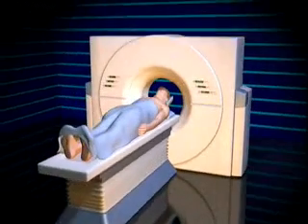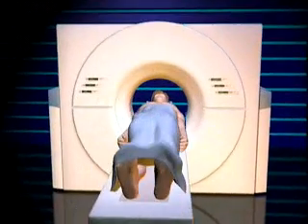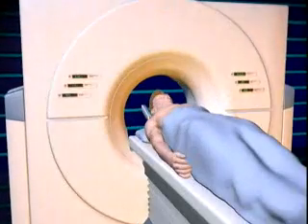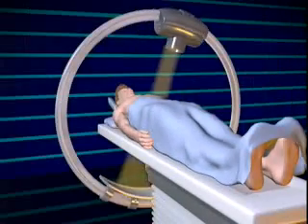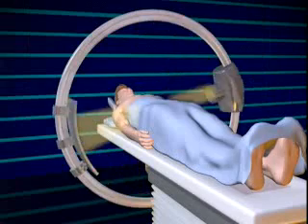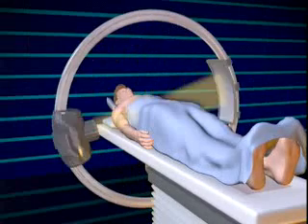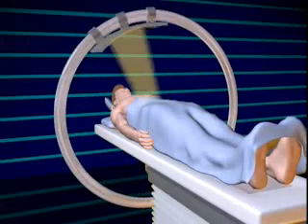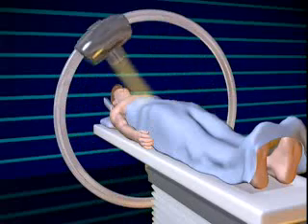While x-rays are limited to two-dimensional renderings, CAT scans are able to generate 3D views by rotating a conventional x-ray beam in a spiral around the patient's body. This series of rotations around the body creates image slices.